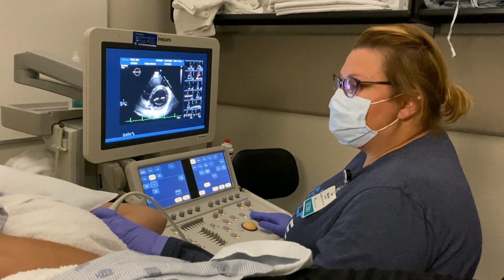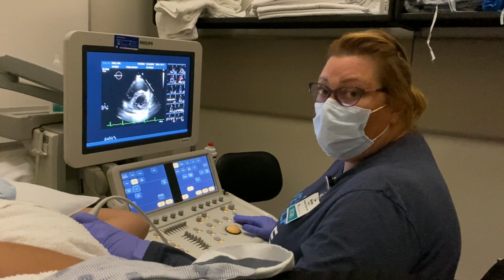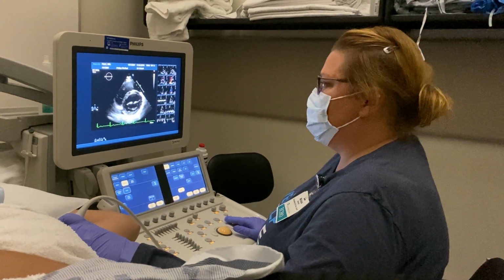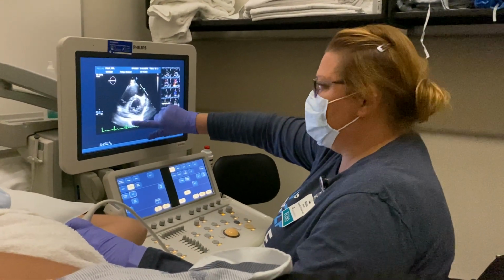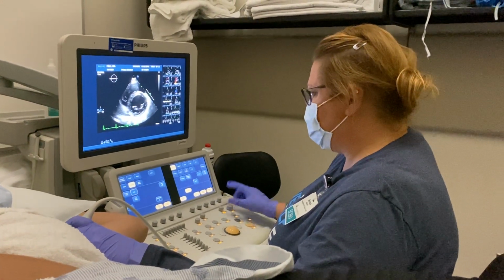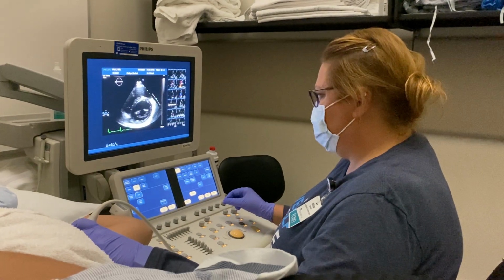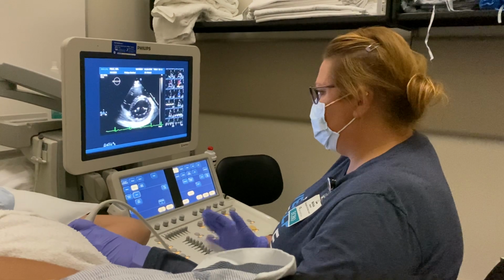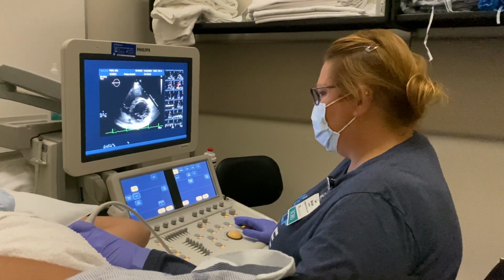To clear this image, climb towards her sternum or move medial towards the sternum. Again, with this image, what you're looking for is a perfectly circular image. You don't want it to be oval. You want it to be nice and circular. Again, finger width of depth below, adjusting the focus to the area of interest. Take this down one. I'm going to adjust my TGCs in the far field here. And I'll clip it.